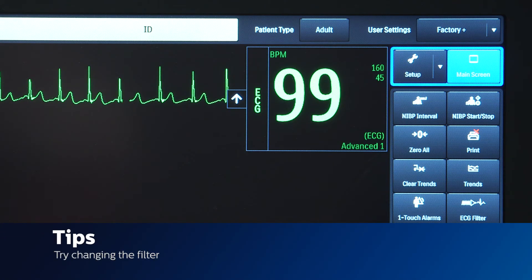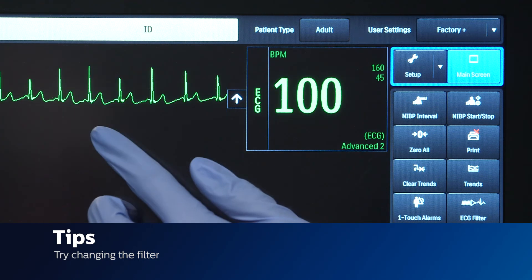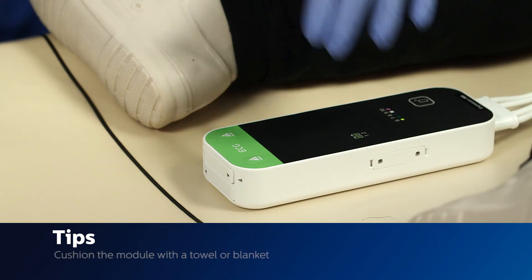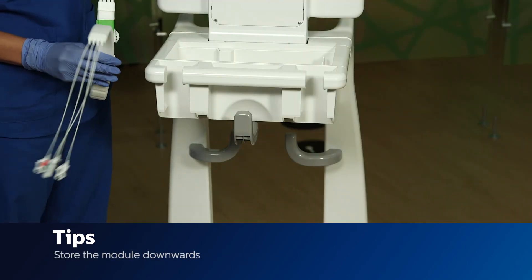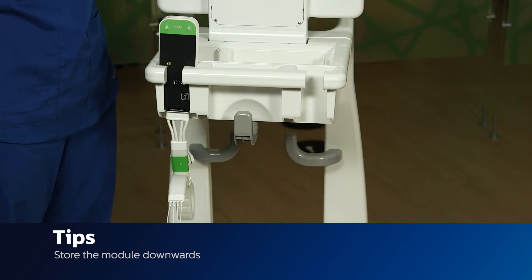If you start your scan and begin to get artifact, try changing the filter — these filters were made to weed out different noises from the MR. Place the module on a cushioned surface such as a blanket or towel to minimize MR vibrations. When storing the module after the case, make sure to store it downwards where the leads are hanging, as storing it upwards will stress the cables and eventually break them.